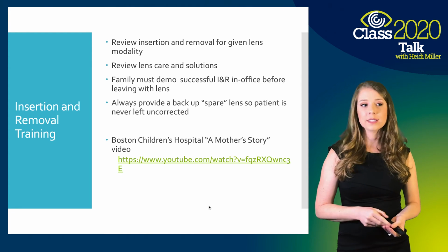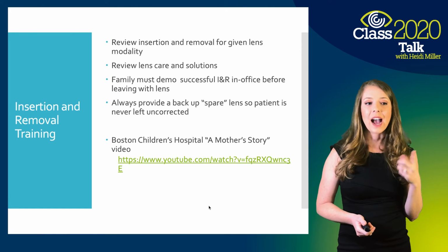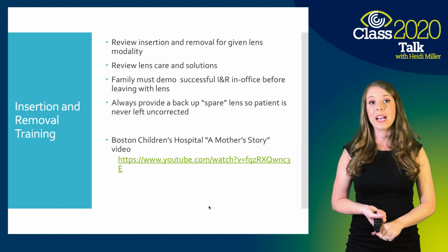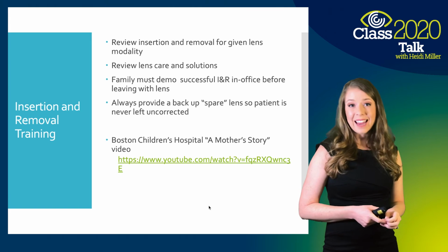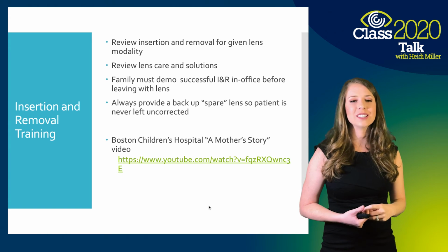I just wanted to insert this URL because I give a printout of that URL for the Boston Children's Hospital video. It's a really good video on how to insert soft lenses or any soft lens for aphakia. It's a little dated, but it's a safe video. Everything she says in there I totally think is okay and safe for patients to view.